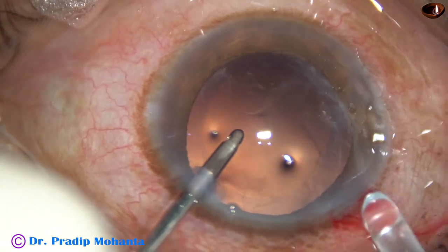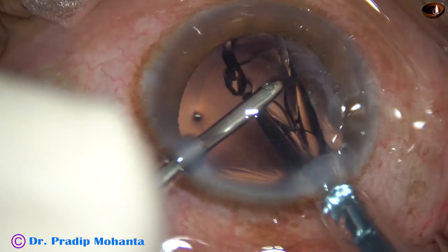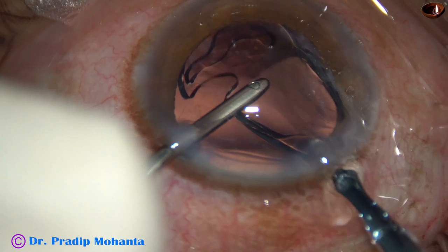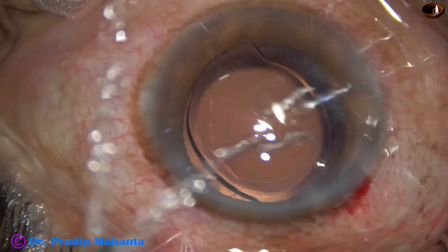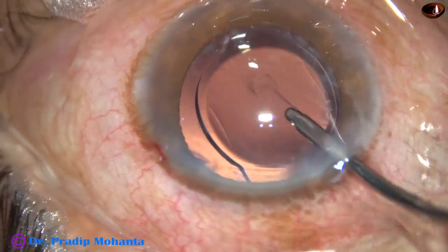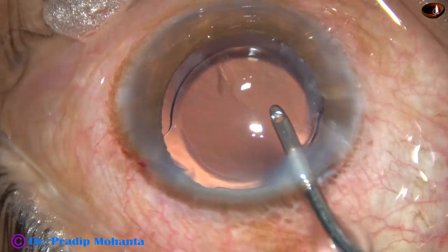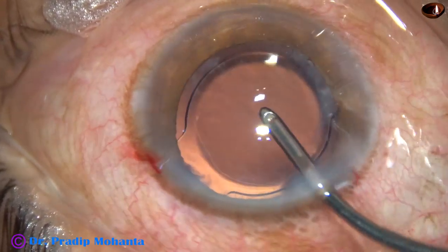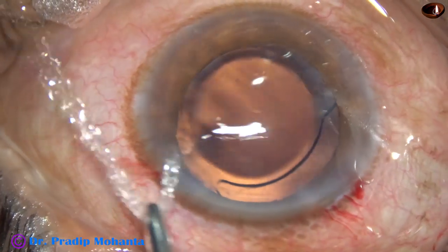Now this is hydro-implantation. The anterior chamber is kept formed by irrigating fluid and an intraocular lens is placed in the capsular bag. This is a hydrophilic monofocal intraocular lens, and the lens has gone into the capsular bag.